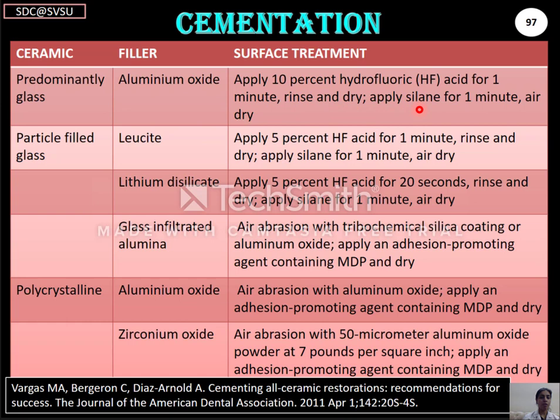In particle-filled glasses, which can be leucite or lithium disilicate, first, 5% hydrofluoric acid is applied for 1 minute in case of leucite-based and for 20 seconds in case of lithium disilicate-based ceramic, which is then followed by rinsing, drying, followed by application of silane bonding agent for 1 minute, followed by air drying.